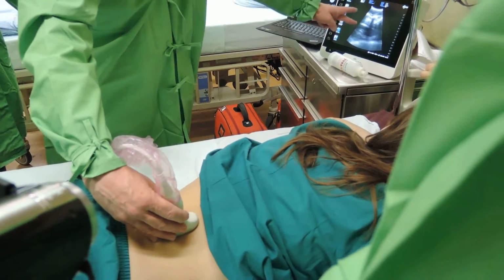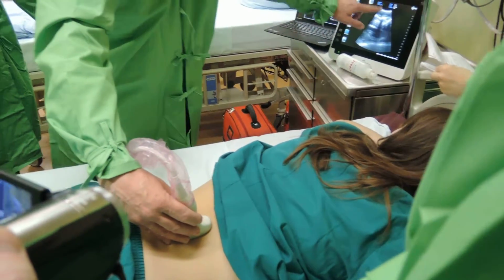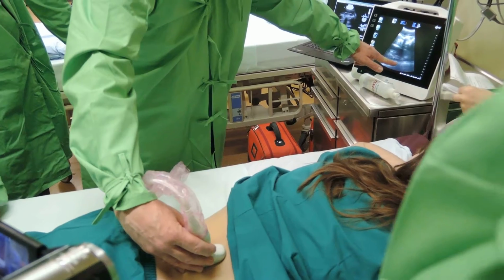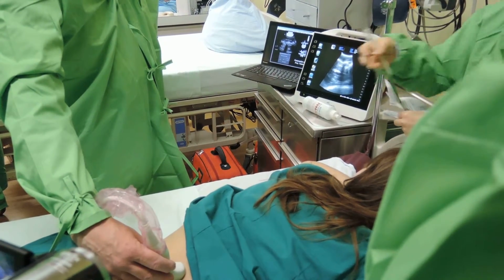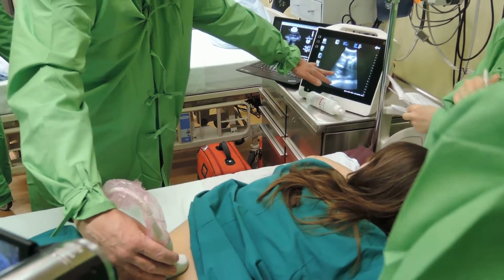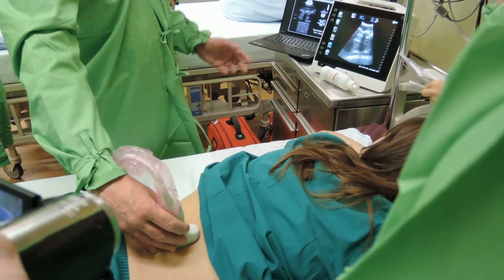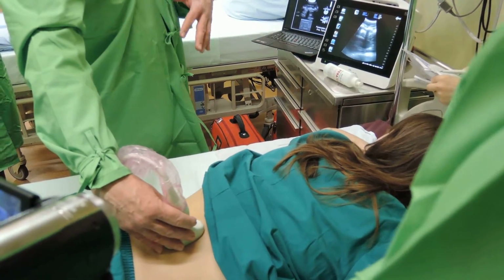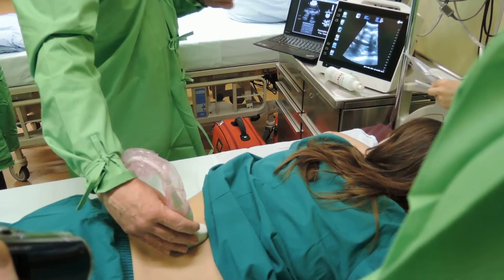So we can look through her. This is the anterior abdominal wall, and this is the abdominal cavity. She's a model, really. She's a wonderful model: everything is visible on her, and very well.